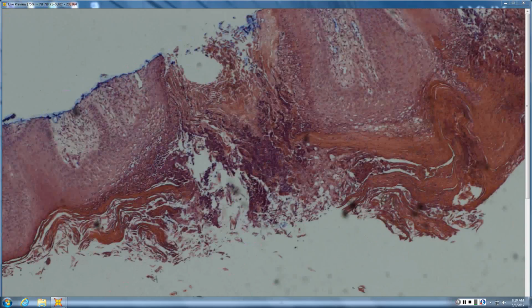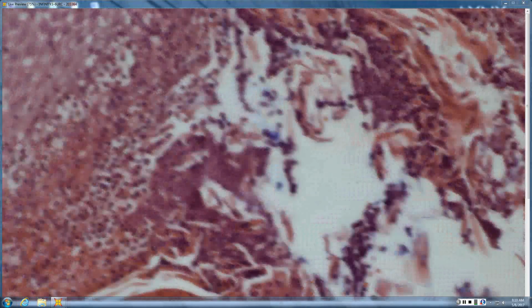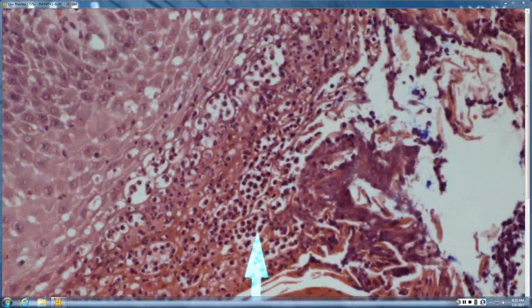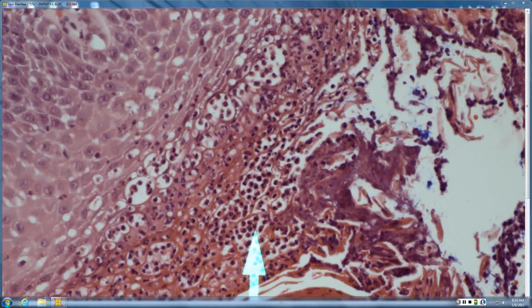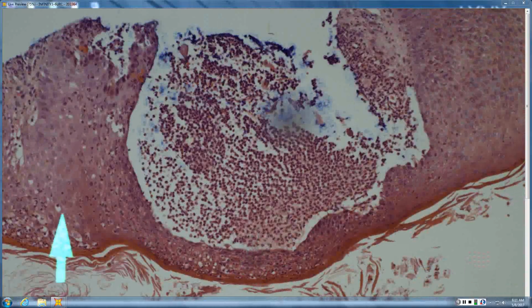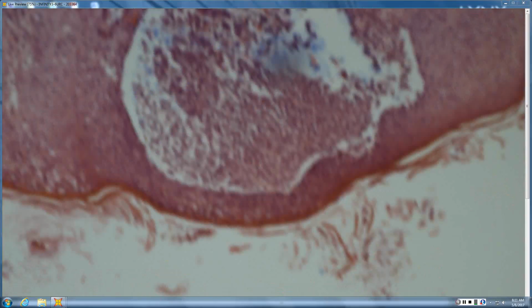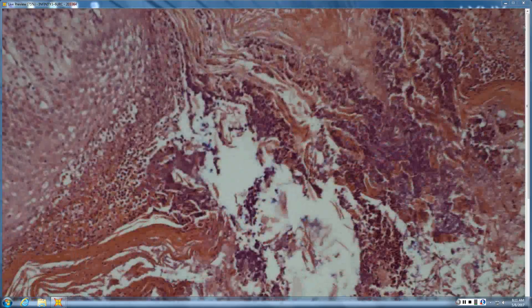Trying to figure out. These are like big dilated hair follicles. So yeah, big dilated hair follicles, and what are all of these cells? So those cells, we can go a little higher and look. I mean, like a pinch of folliculitis. Those are neutrophils. So there are lots of neutrophils related to a hair follicle. Absolutely, folliculitis is one thing you'd think of. Neutrophils in the epidermis and stratum corneum, what is your differential? Okay, so yeah, I guess we're in the psoriasiform differentials, so like psoriasis, tinea, impetigo, candida, seb derm, syphilis.